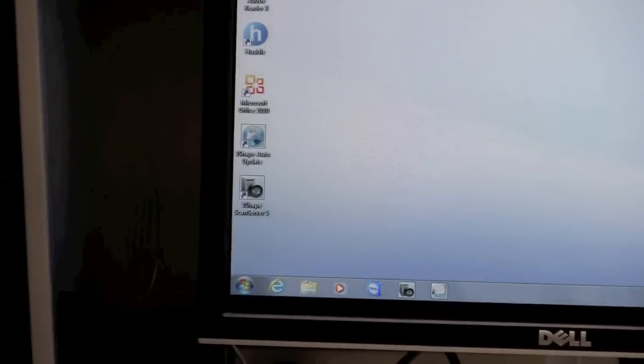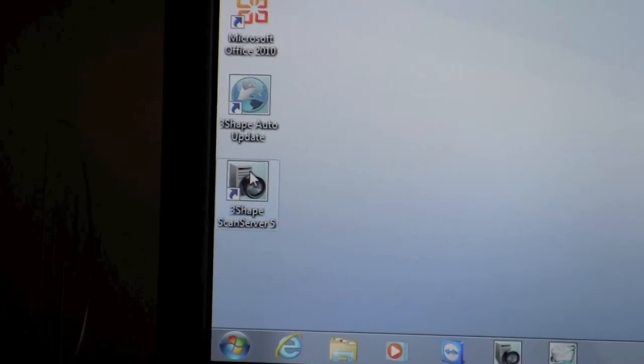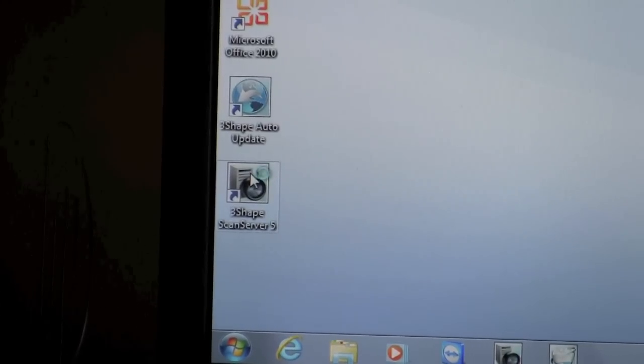The 3-Shape Scan Server should also be in the form of an icon on your desktop. We'll move over to the left — usually it'll be in the bottom left-hand corner — and it should be entitled '3-Shape Scan Server.' If you just double-click that icon, you should get a window in the center of your screen. The 3-Shape Scan Server will start up, and of course you can hear the motors inside of the scanner moving.